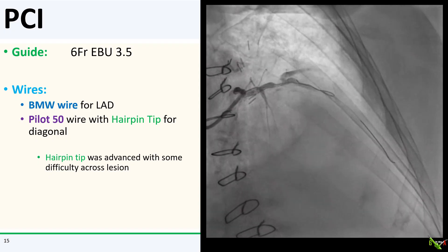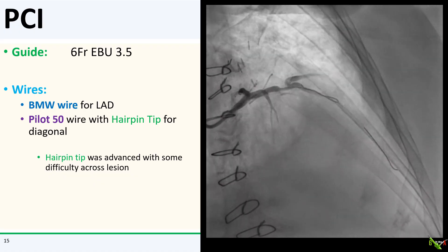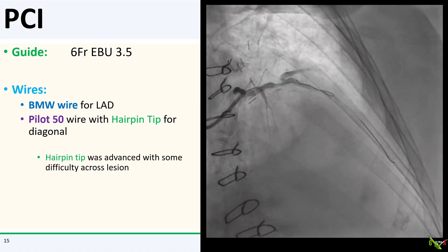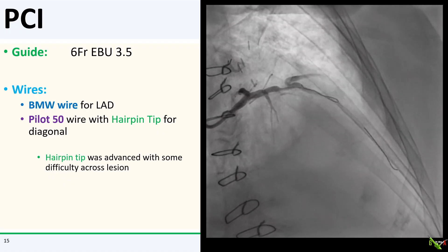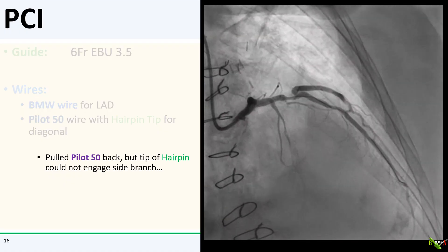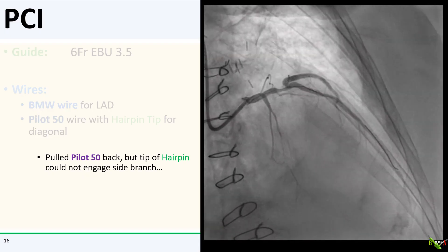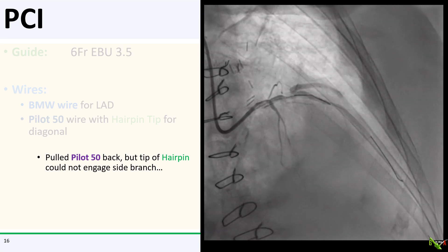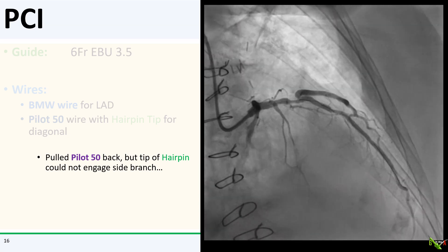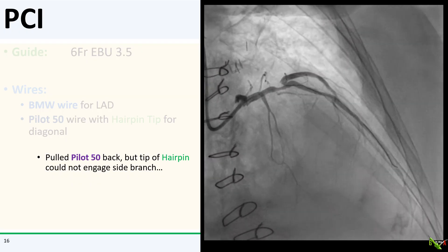With a bit of manipulation, I was able to get my hairpin tip beyond the lesion. As you can see here, the tip was actually pointed nicely toward the ostium of the diagonal. I slowly pulled the Pilot 50 back but had a tough time getting the tip of the hairpin to engage the diagonal. These things always seem to be a lot harder to do in real life than they make it seem at conferences.